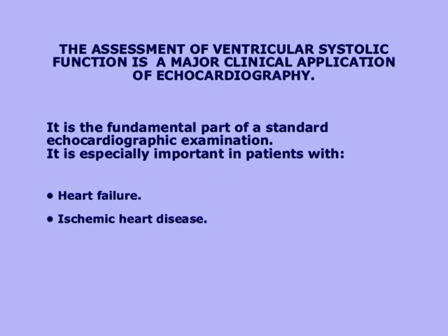A major clinical application of echocardiography is the assessment of ventricular systolic function. This is a fundamental part of the standard echocardiographic examination, but is especially important in patients with heart failure and ischemic heart disease.